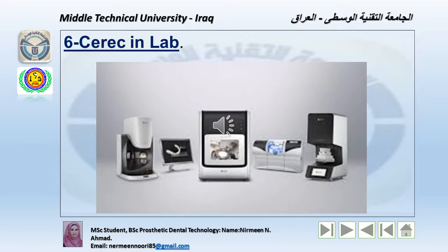Cerec Lab is the sixth type of the CAD-CAM system. Cerec Lab was market launched in 2001. Cerec Lab is a laboratory system in which the working die is laser scanned and the digital image of the virtual model is displayed on the laptop screen.